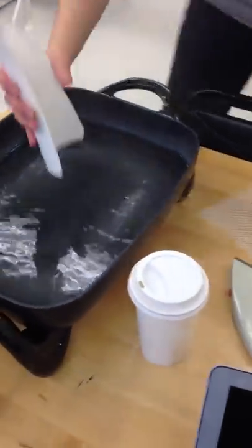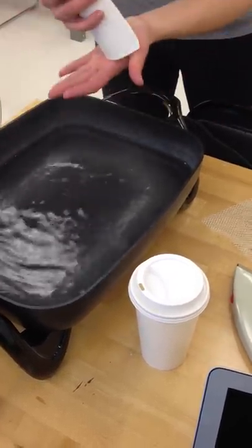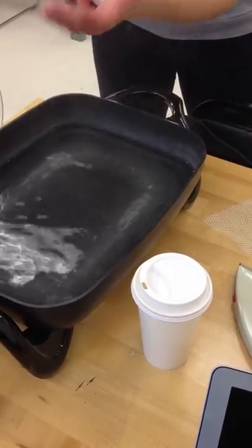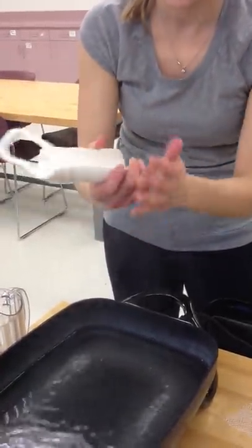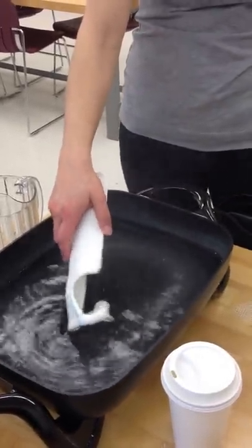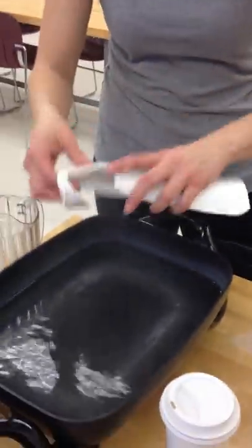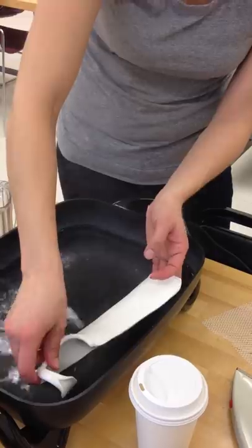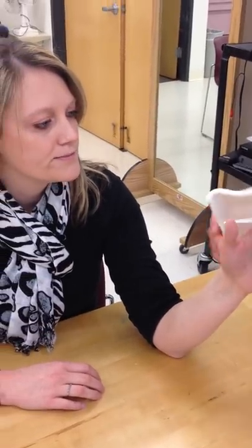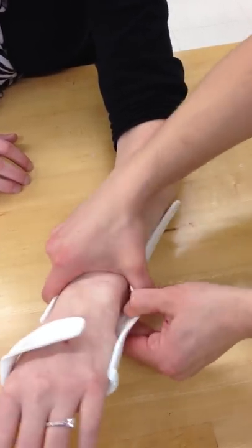You're always going to want to flare the bottom here. Just stick that part in, get it nice and warm, and flare it out — so you're not going to get pressure at the end. It doesn't have to be crazy, just a little bit of a flare. Make sure you're not sharp anywhere. You'll know your pressure points, so you can bubble it out so it's not going to hit the patient.